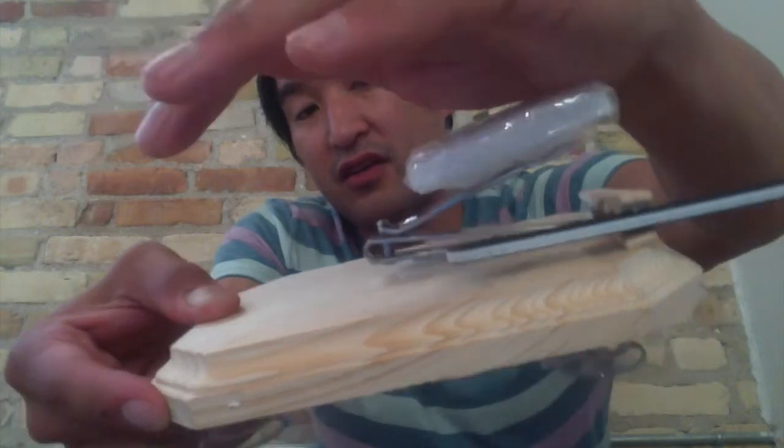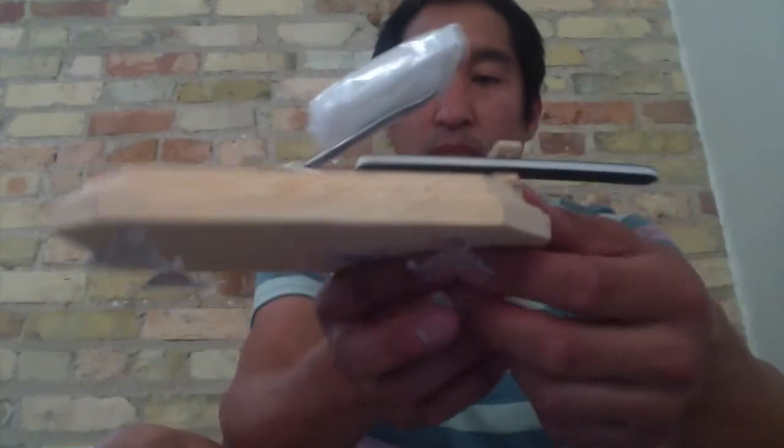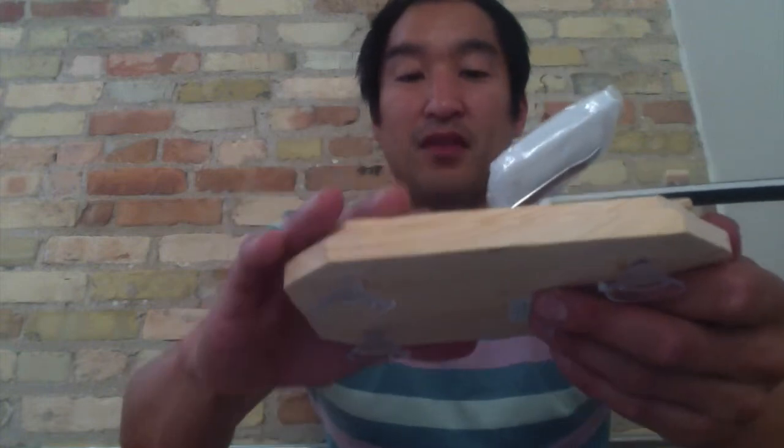Attached on the side here is a file, so they can also file their nails as well. And then it's on a clothespin, so you could actually take it off and adjust as needed, change it to the other side, or change the file when it's worn out. And lastly, the wood base provides support for the fingers and hand, and that makes it easier for them to switch digits as they cut.